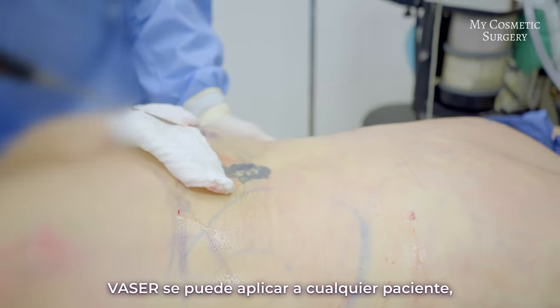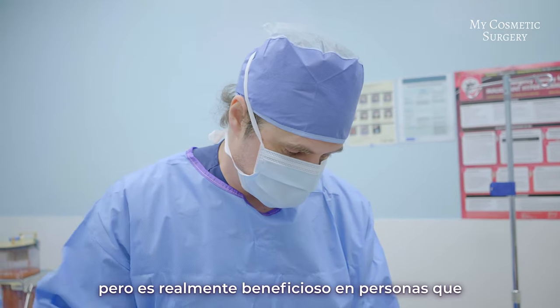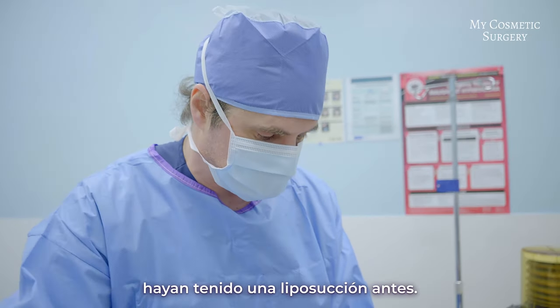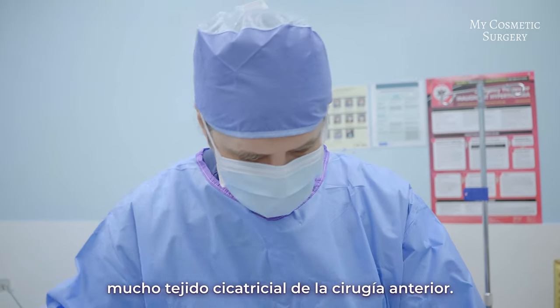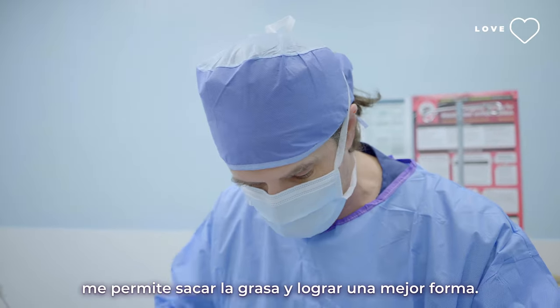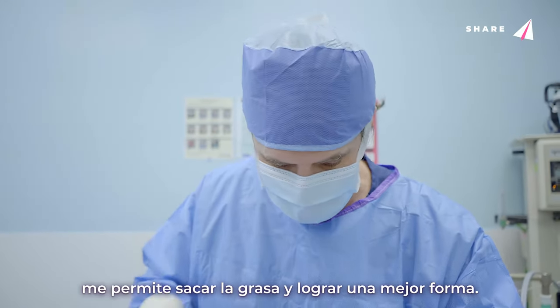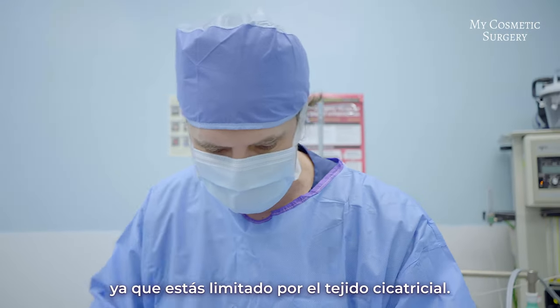VASER can be applied to any patient and works great for everybody, but it's really beneficial for people who have had liposuction beforehand, because those patients have a lot of scar tissue from the previous surgery. The VASER really helps to break it up and allows me to get that fat out to get a better shape. Without it, it's much more difficult because you're limited by the scar tissue.